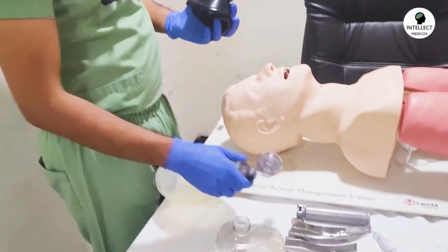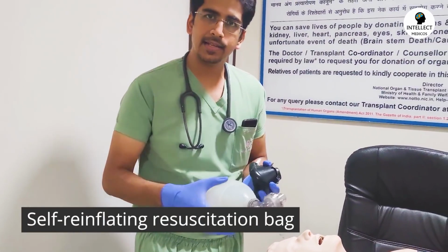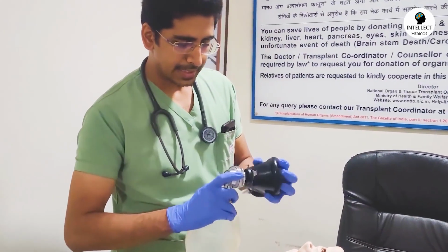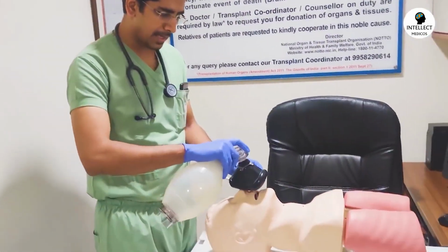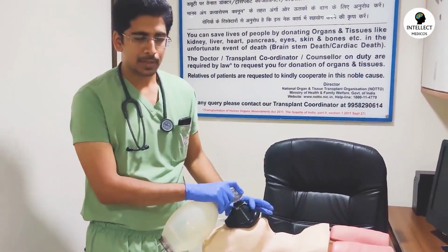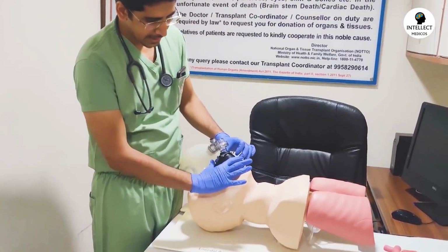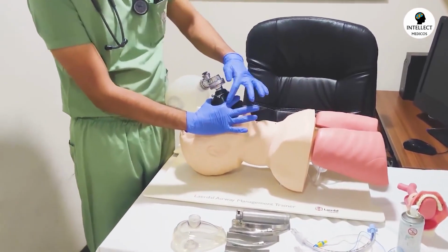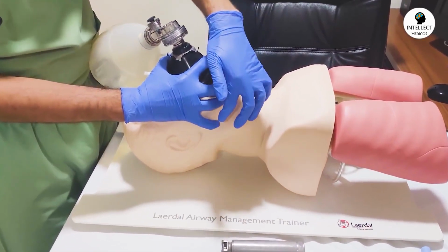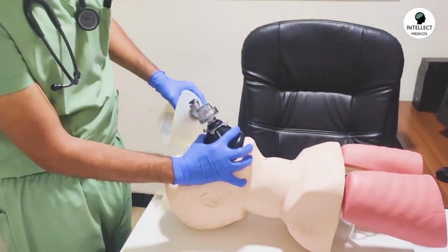Now, as I already said, this is a bag. This is called a self-reinflating resuscitation bag, also called an Ambu bag. Now, attaching it, you need to hold the mask with a C and E technique. Although I prefer to use my left hand, just to show you, I will show with my right hand. The thumb and the index finger should be like a C, standing for compression of the mask onto the face of the patient, and these 3 fingers should make an E so as to elevate the jaw.